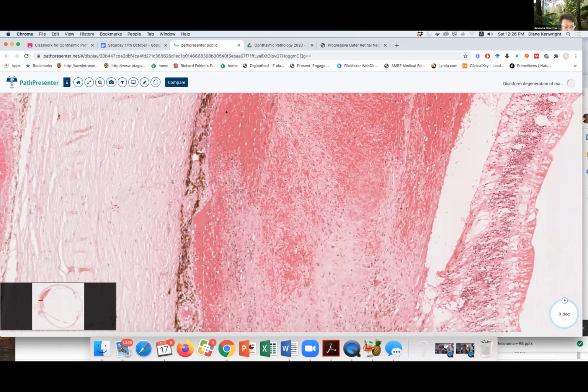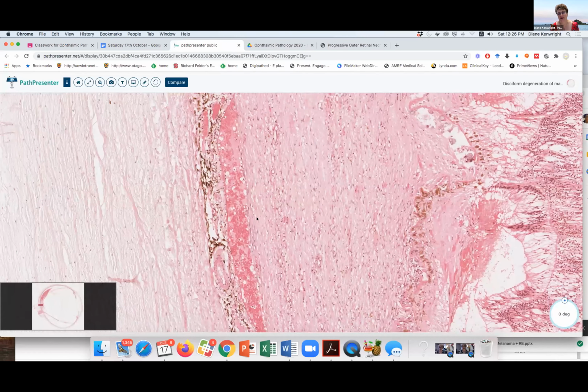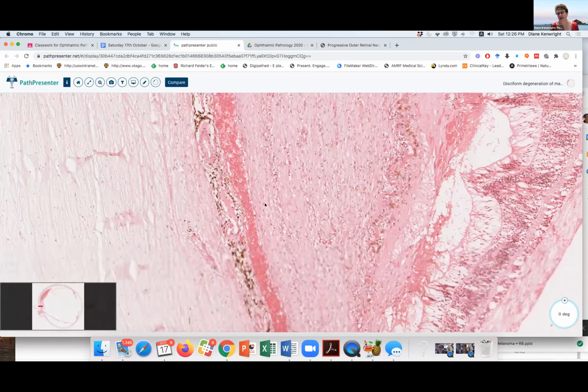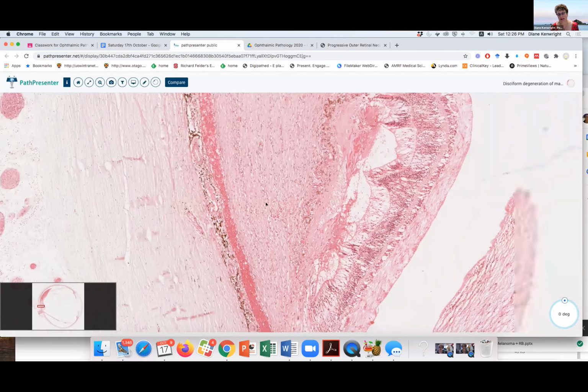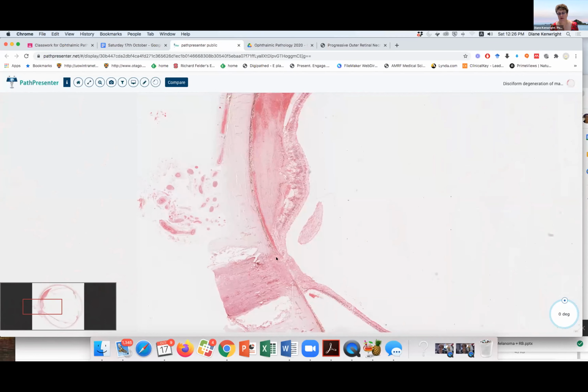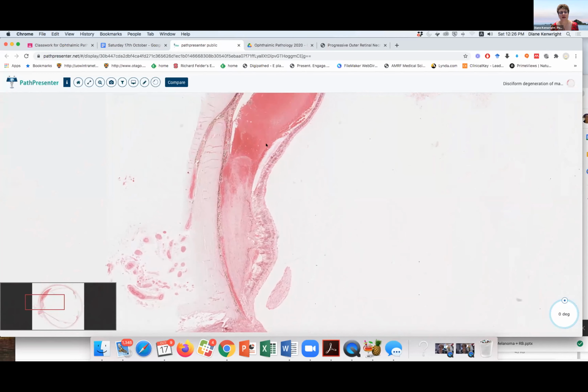It looks like regular choroid though. Regular choroid, yeah, and all the proliferation's probably within the scar. There's blood vessels within the scar. So maybe the scar's replacing that. And probably the destruction of the macula is related to why we've got atrophy here of the optic nerve. Less signal going through it. Yeah, so all the stuff's dying off.